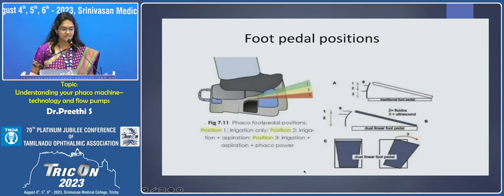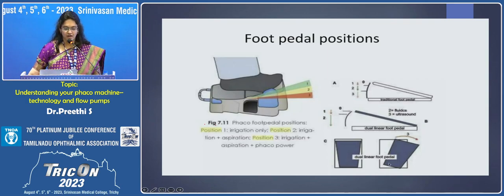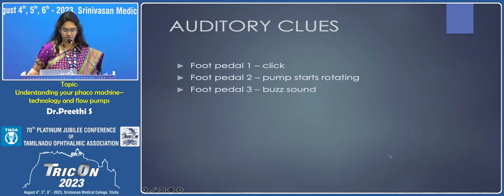So these are the basic foot pedal positions. Traditionally, you have three positions, 1, 2, and 3. In position 1, it's only irrigation. Position 2 is irrigation and aspiration. Position 3 is irrigation, aspiration and Phaco power. Recently, there is a dual linear foot pedal as well, wherein 1 and 2 are linear, pressing down. The third will be in the horizontal direction, with a similar linear control.